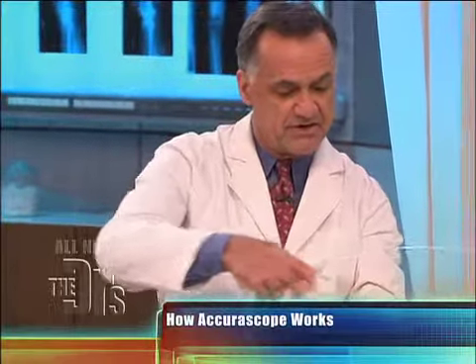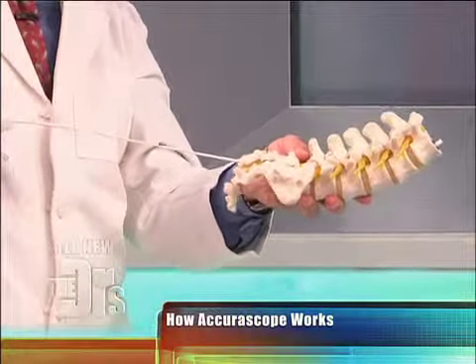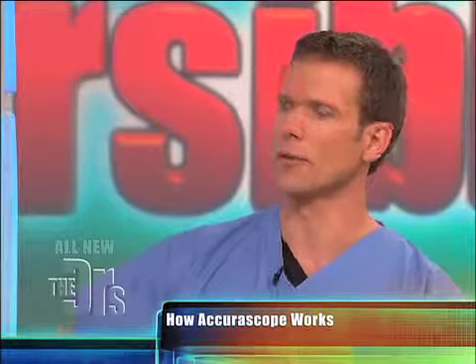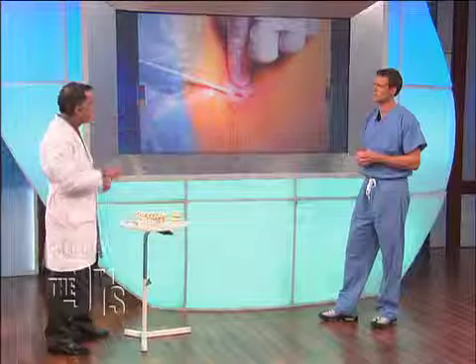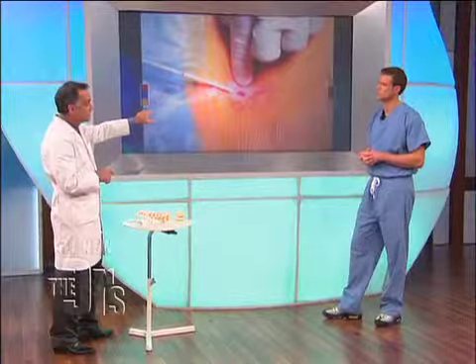Through this small incision — this is the patient's back here — a small incision right over what we term the natural opening, we pass this in. We're able to make these small incisions now where you used to have to make big, long incisions in someone's back. It's hard to get a smaller incision — it's just a fraction of your finger width. You can see it there right at the end of surgery. Two weeks later, most people can't even find the incision.